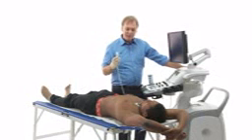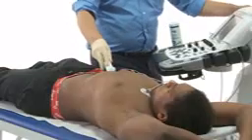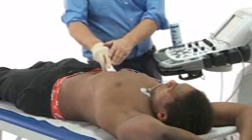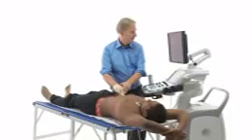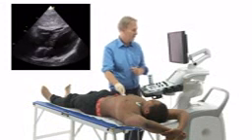Now, we have the patient lying on his back, and we put the transducer subxiphoid, in other words, underneath the sternum, and then we use a lot of ultrasound gel, and we simply advance the ultrasound probe towards the left shoulder. And at the same time, we let the patient inhale. Okay? And then we will see the subcostal four-chamber view.